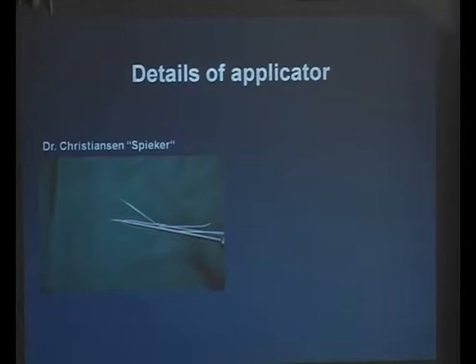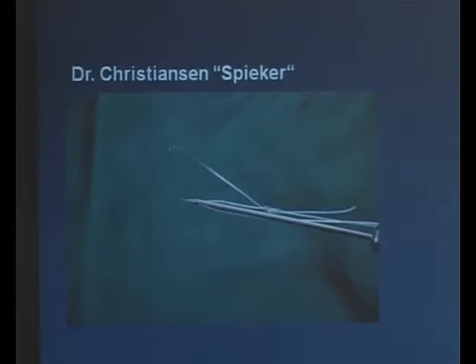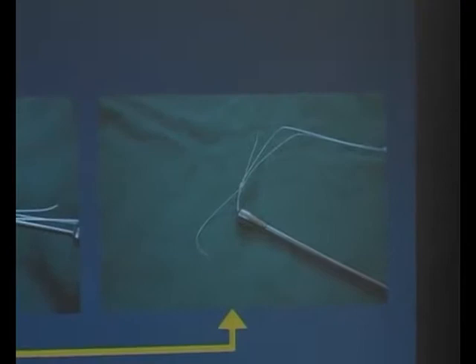This is the tip of the applicator. So we fix the toggle straight to the tip of the applicator. Leave the knot a little bit behind the tip because of the resistance to bring this knot through the skin. The skin will go in front of your needle, so you bring down the knot a little bit to the back. And before you go in with your applicator, you look, the sharp point is inside the applicator.